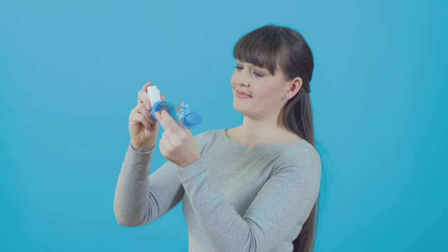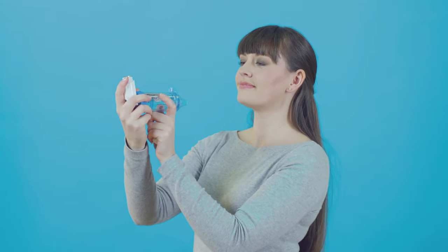Put your inhaler into the hole at the back of the spacer. If your spacer has a cap, take it off. Sit or stand up straight and slightly tilt your chin up, as this helps the medicine reach your lungs. The next steps all happen smoothly in one action.